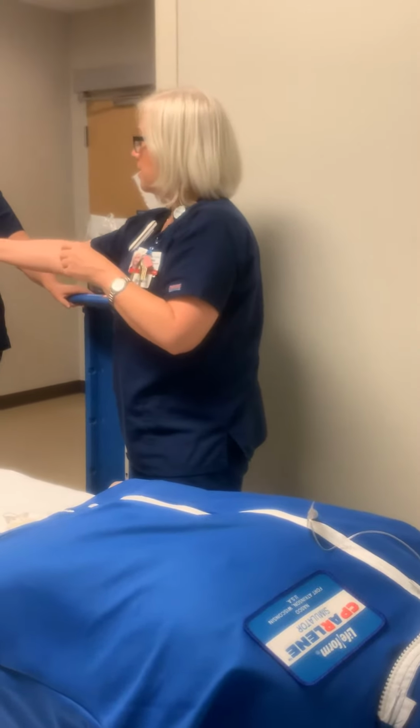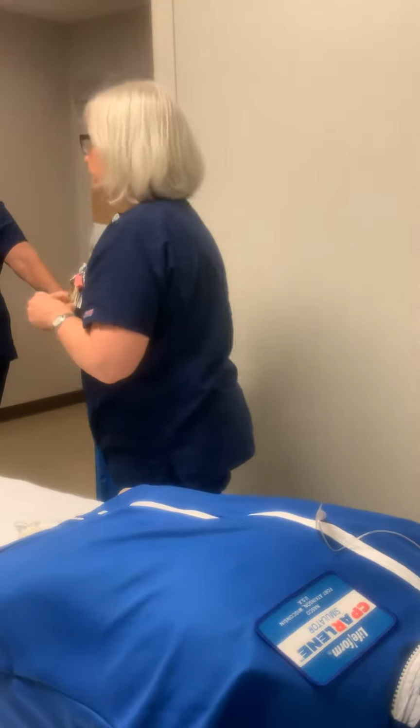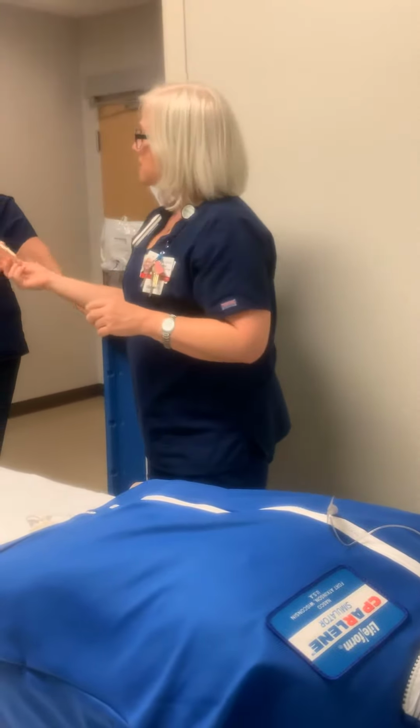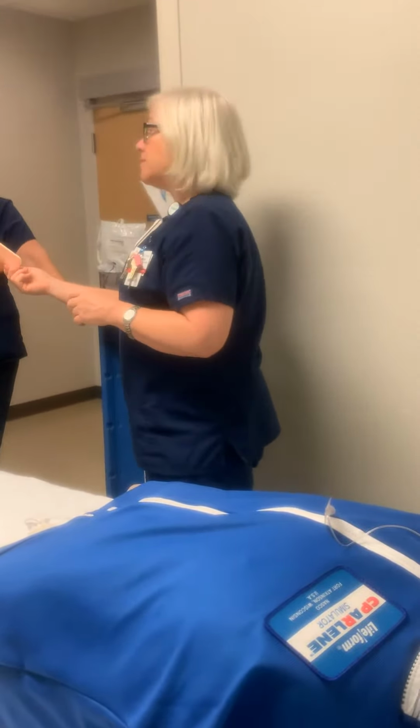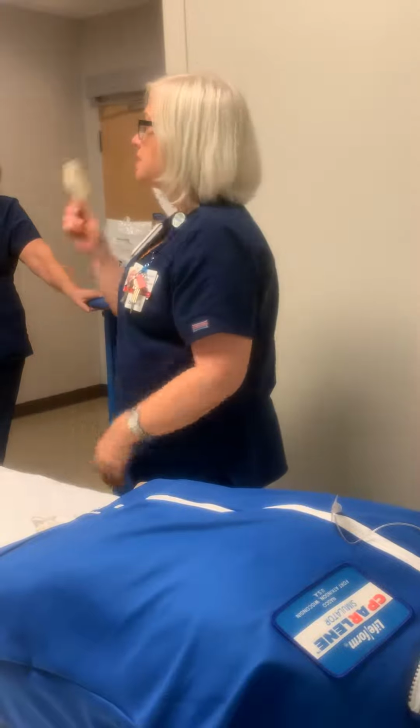They seem thick. We have drain sponges that already come cut, so they're clean, you know, the clean gauze. And the problem with those is that this seems thick though, but it's not. It's not at all. And we use them all the time at Gateway, and they've really decreased our pressure ulcer rate. These things are amazing.